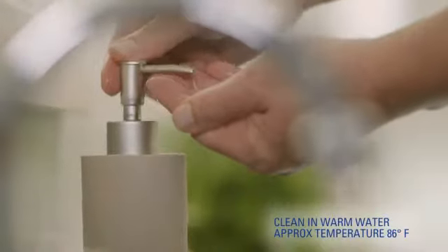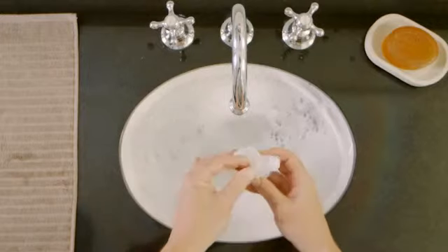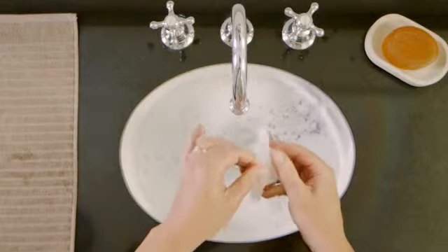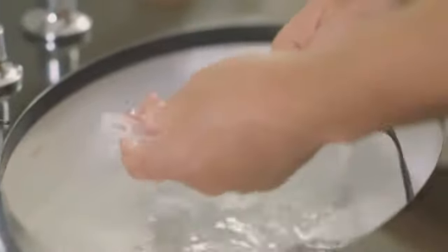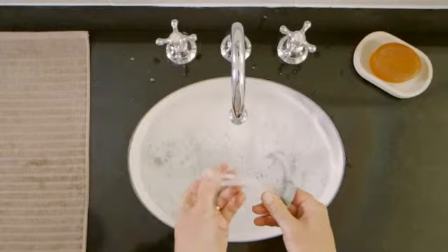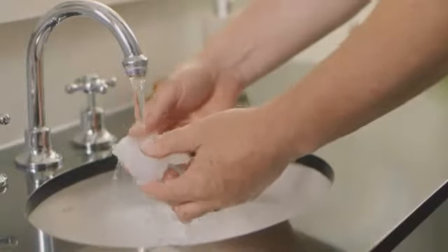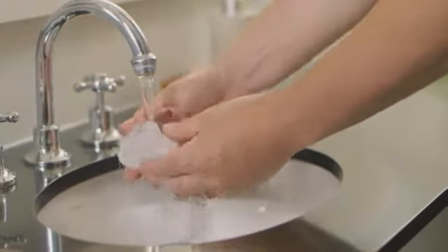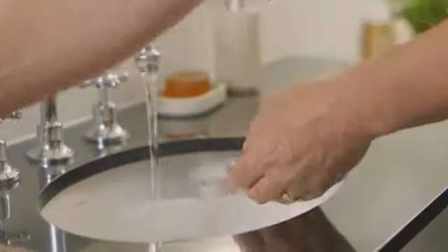Hand wash the cushion and tubing daily in warm, soapy water. Avoid products containing bleach, alcohol, conditioners, and moisturizers. Clean your headgear the same way once a week, and you don't have to remove the back strap to do it. After rinsing in regular drinking water, allow your mask components to air dry completely and keep components out of direct sunlight.